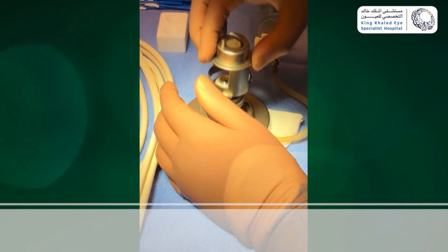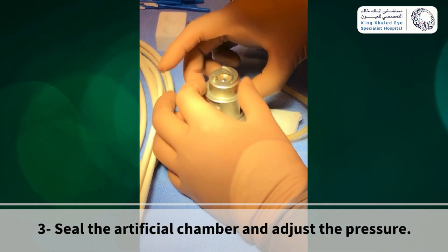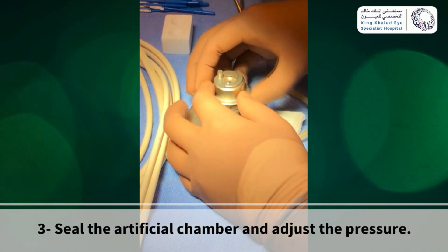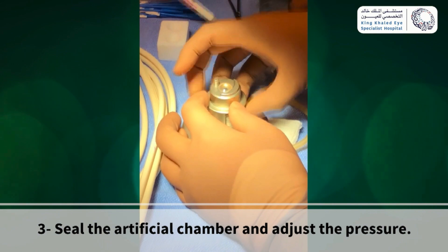Now fit the chamber cover over the base locking ring, then lock it by rotating it clockwise. Then raise the piston and finish tightening the chamber to the base.